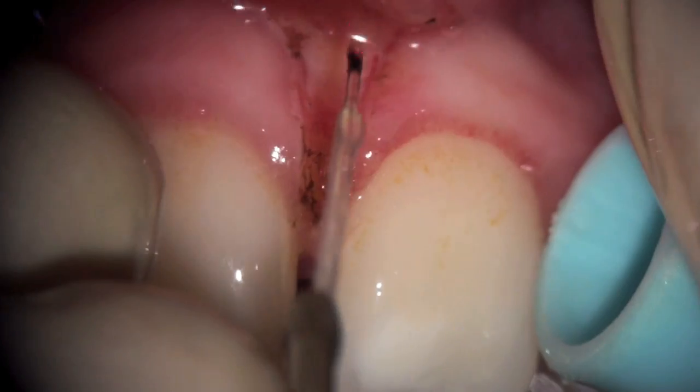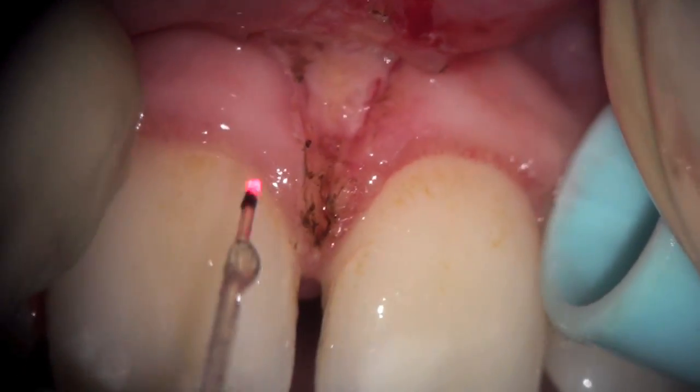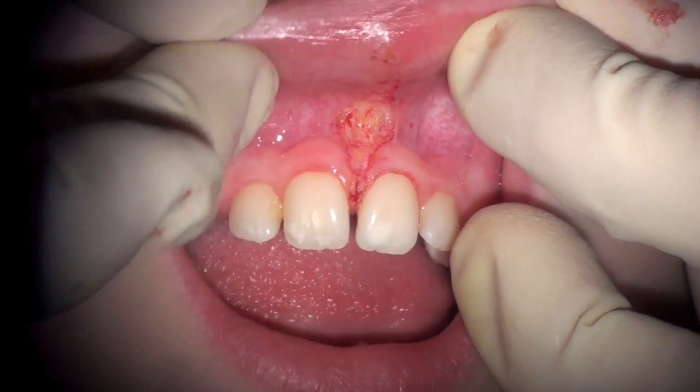At this point we're actually using a pulse setting, because I've finished most of the work — now at 2.2 watts with 30 microseconds on and off. You can see the final post-operative result here, immediately after treatment.